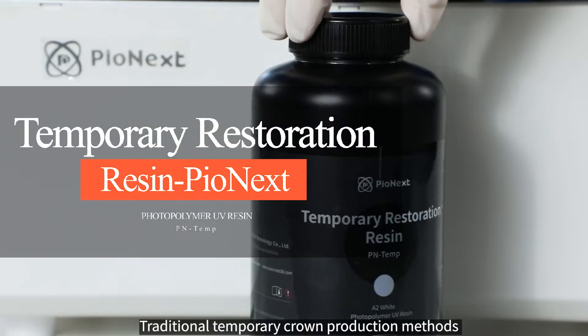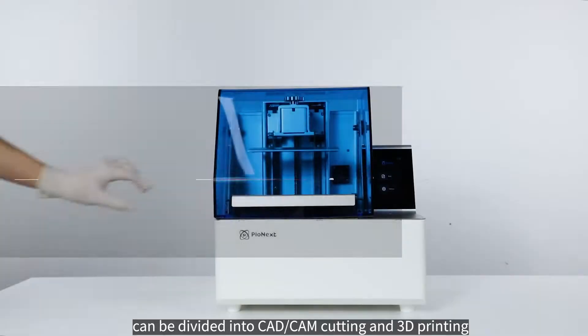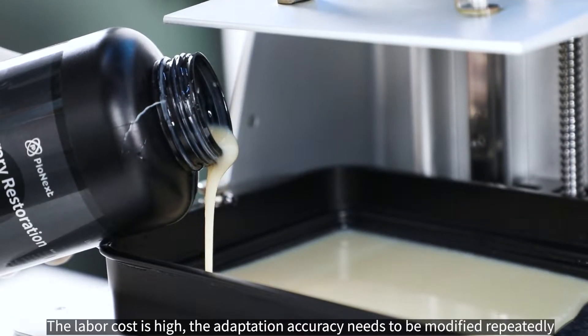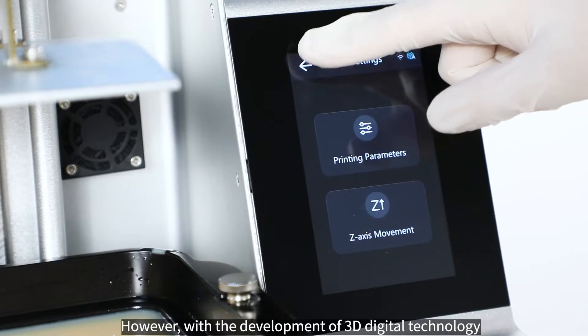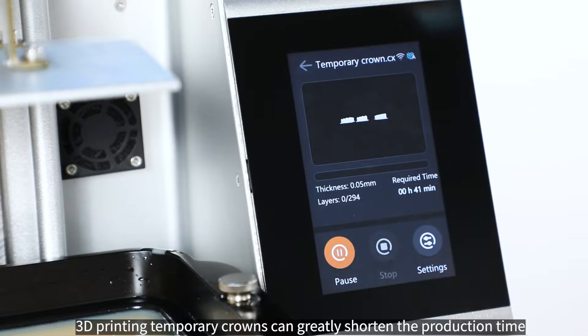Traditional temporary crown production methods can be divided into CAD/CAM cutting and 3D printing. The former requires cutting and other complicated processes; the labor cost is high, the adaptation accuracy needs to be modified repeatedly, and the production time is long.